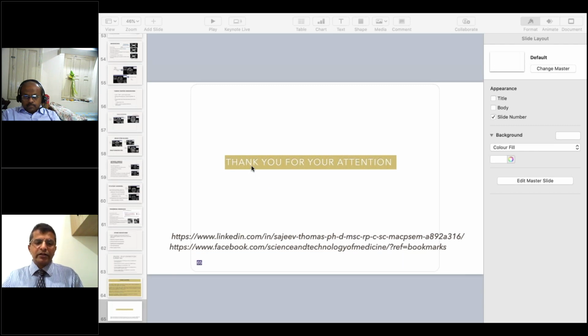Another question I have is, what is the prescription isodose used in Gamma Knife? The prescription isodose used is from 40 to 60 isodose line, which is different from other systems. In previous practices, the Gamma Knife units used to prescribe at the 50% isodose line. But in current Gamma Knife practice, especially with the Perfexion, we are using 40 to 60% because that gives a better dose fall-off.